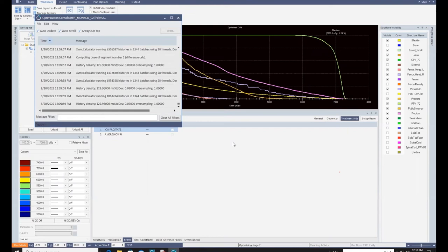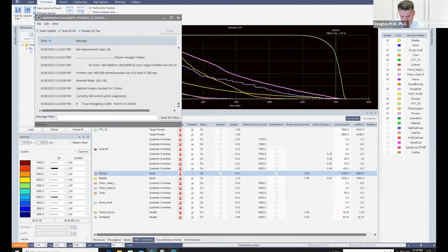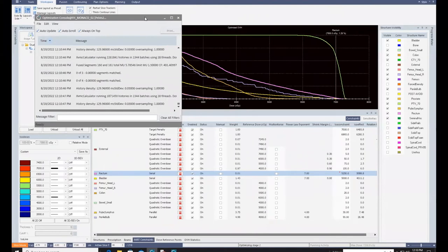I can share the experience of what actually happened. The conformity index I calculated from that equation was 0.998. But once my plan was evaluated by that software, they gave me 1.2. So I don't understand why it becomes 1.2 in that software, when it was one in the... So what is the actual difference here? Are you looking at this under the sensitivity tab, the one that's automatically calculated in the planning system? Or are you talking about the one that you calculate on your own? Yes, when I calculated my own, it was about one, that means 0.998. But once I submitted that plan with the software, it showed me 1.20.